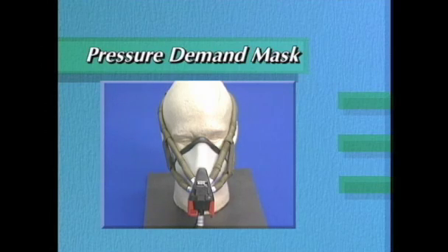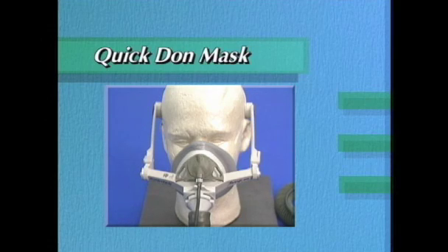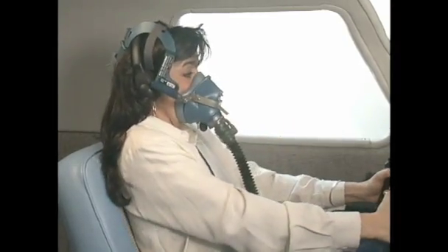The latest generation of oxygen mask is referred to as pressure demand. These masks are designed to create an airtight oxygen seal on the face. The inhalation and exhalation valves are designed to permit oxygen pressure to build up within the face mask, thus supplying oxygen under pressure to the lungs. Quick-don crew oxygen masks have a quick-release holding strap or a quick-release storage container that allows for rapid access to the mask. During an emergency situation requiring the use of oxygen, the pilot should be able to release and don the mask within 5 seconds.